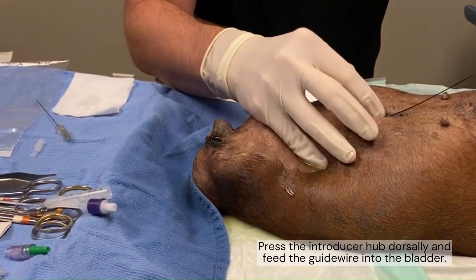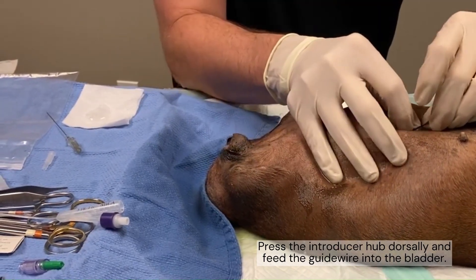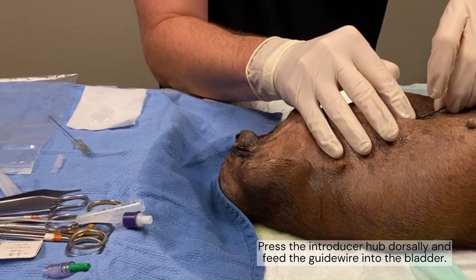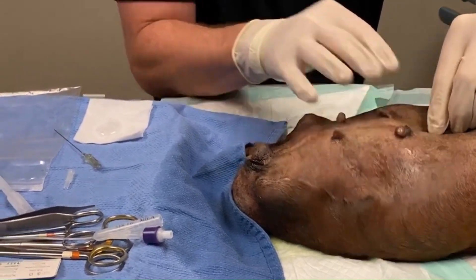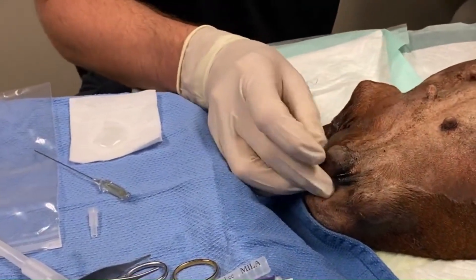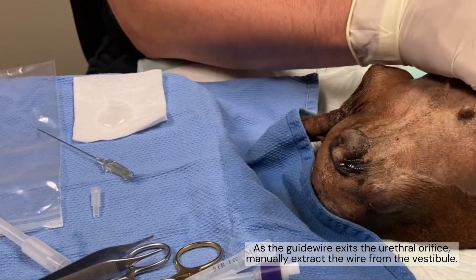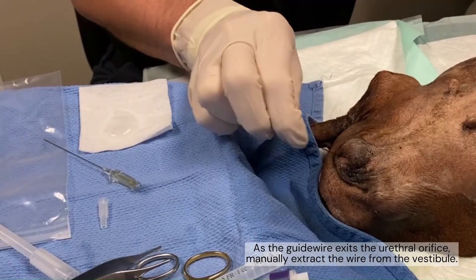You want to push down on this hub because it directs it in the angle that we want. And I can actually see it — you can see it hitting right here. So we're at where we need to be. There it is. We got it out.